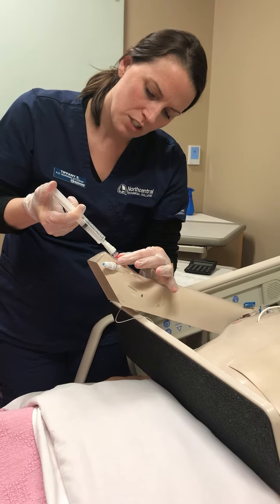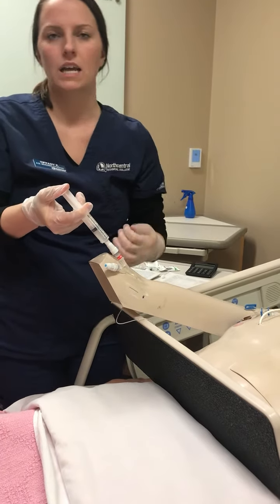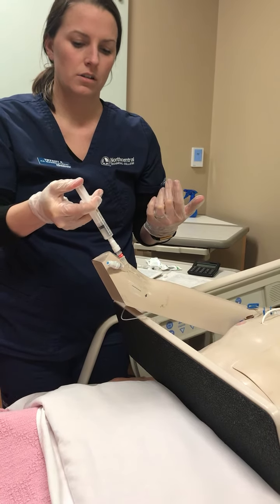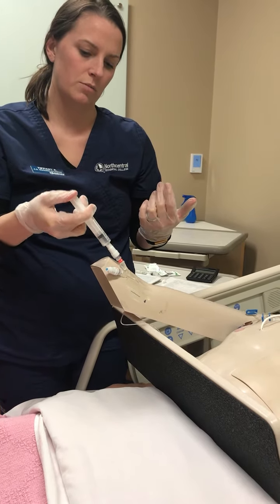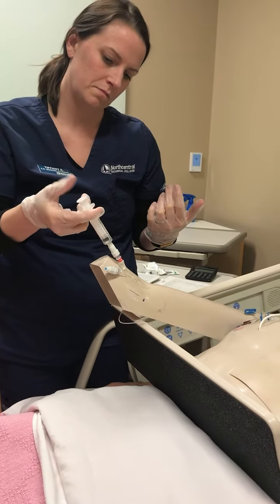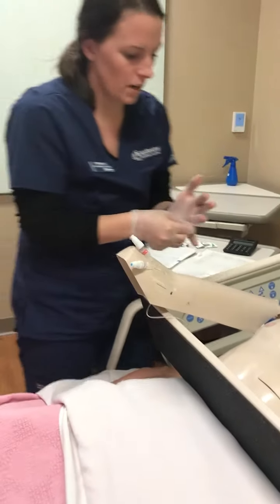And so I'll flush this in about 5 milliliters, and then after that, with this being a PICC line, we do the pulsating flush. So for the remainder, I can do a pulsating flush, which creates some turbulence.